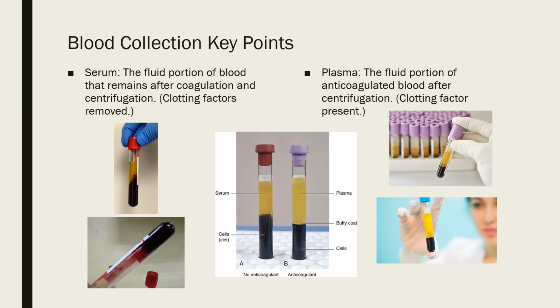When that specimen clots, you can see here in this bottom image where that specimen has clotted and you've got all of that specimen maintained in one big gel clump right here at the bottom of this tube. So when you turn this tube on its side, it does not flow down.